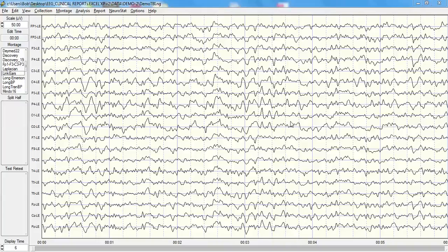This is a demonstration of seamless integration of the clinical assessment of the patient, the measurement of EEG, and then the application of EEG biofeedback, all in one session and in a very efficient and straightforward manner. This is a situation where a patient appears for the clinician.